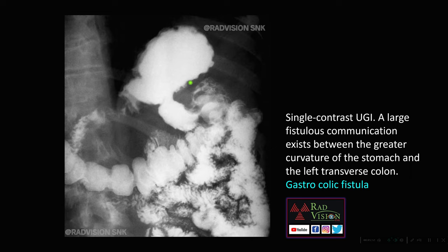Here on upper GI barium studies you can see barium in the stomach, but you should not see contrast in the colon. There is an abnormal fistulous communication between the greater curvature of the stomach and the left transverse colon, with contrast seen passing from the stomach into the left half of the colon. This was a case of gastrocolic fistula.